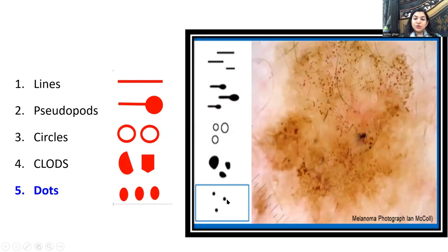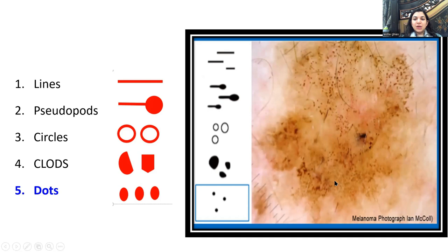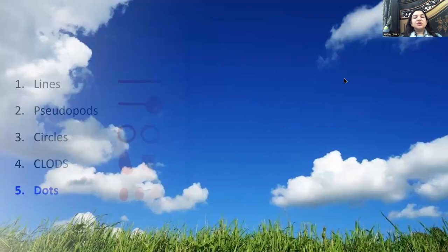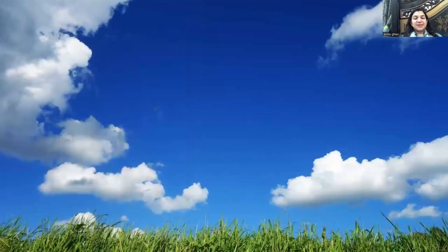Dots are the smallest discernible objects visible with the eyes and usually appear the same shape because they are very small. In this example — a melanoma — the dots are dispersed and focused in one part of the lesion. The other part shows a negative network, which we'll discuss shortly.